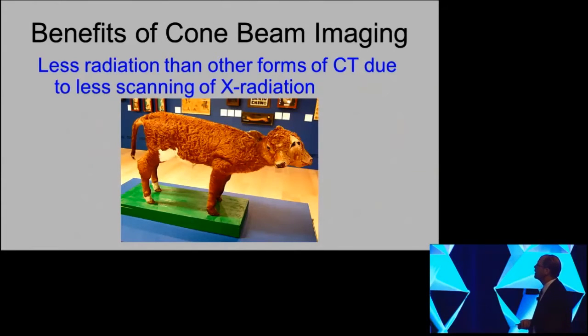So one of the things we hear about cone beam imaging is the fact that it's computed tomography and we can get all kinds of images with a computer, similar to the computed tomography being done in medicine, but it did it at a much smaller dose. And that's true. And of course, we evaluate hard tissue structures, so it's helpful.